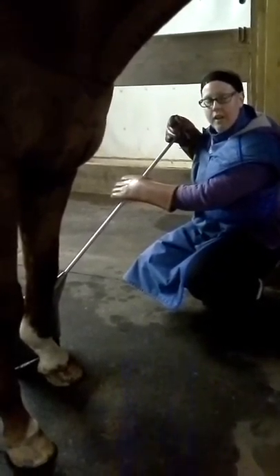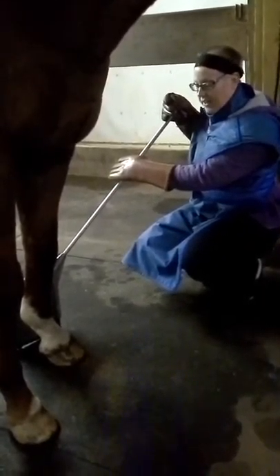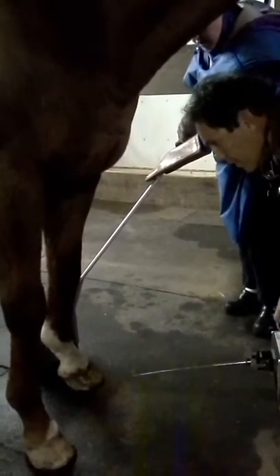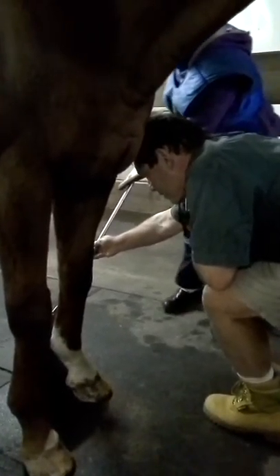My name is Penny Lima and I'm going to be helping the vet take an x-ray of Jimmy the horse, and he's going to walk me through taking this film. The first film you want to take is going to be a straight view. This is the left fetlock, the left ankle. The first one is an AP view, which is completely straight forward.